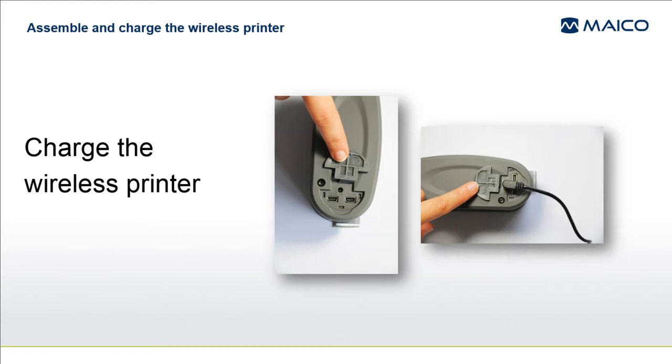Connect the plug adapter suited for your region onto the printer power supply and insert the small round plug into the charging socket on the right side of the printer. It is located under the rubber cover. Plug the power supply into the wall outlet.